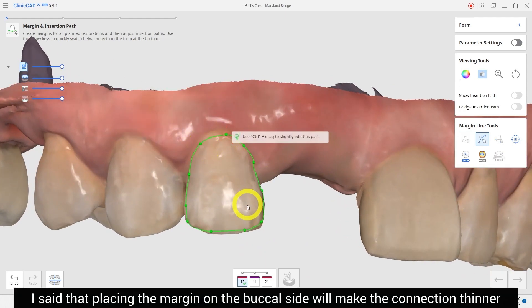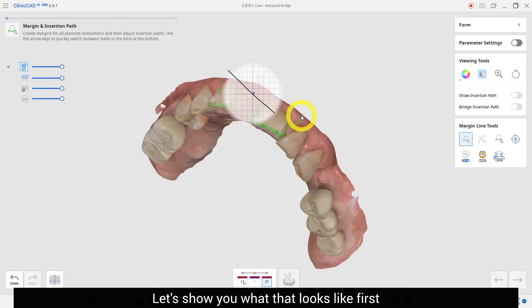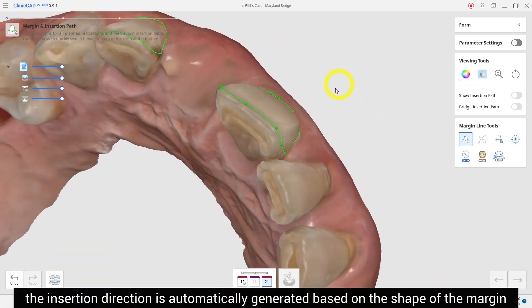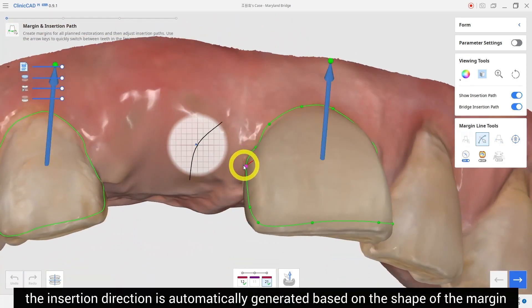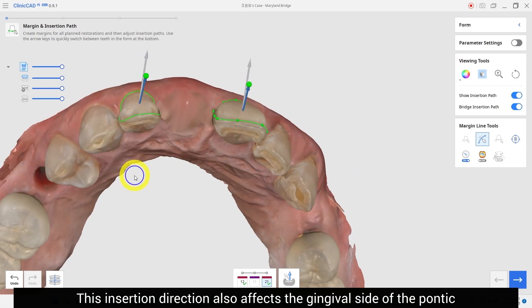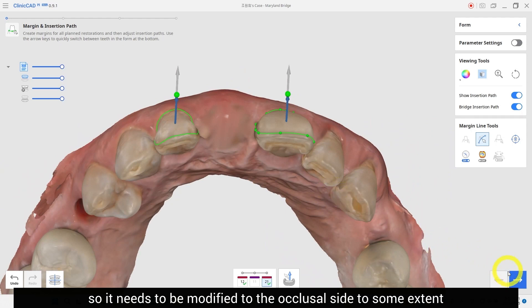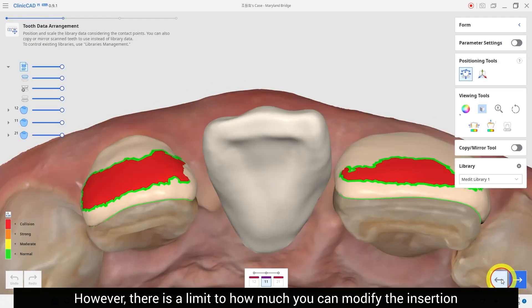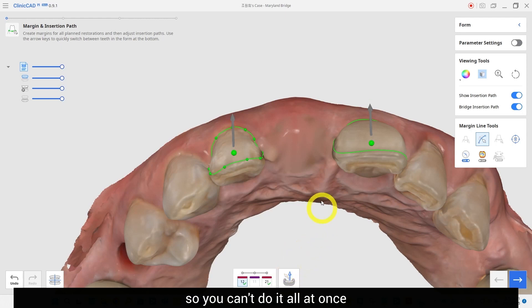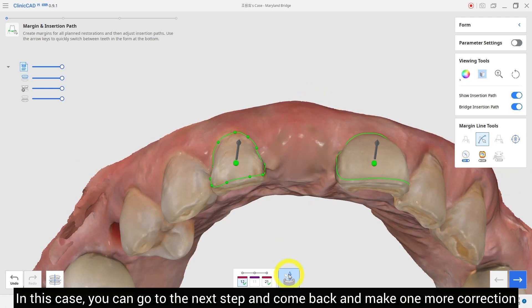Draw the margin of the adjacent piece. Placing the margin on the buccal side will make the connection thinner — let me show you what that looks like. When you connect the last point of the margin, the insertion direction is automatically generated based on the shape of the margin. In this case it will be buccal. This insertion direction also affects the gingival side of the pontic, so it needs to be modified to the occlusal side to some extent. However, there is a limit to how much you can modify the insertion direction, so you can go to the next step and come back and make one more correction.